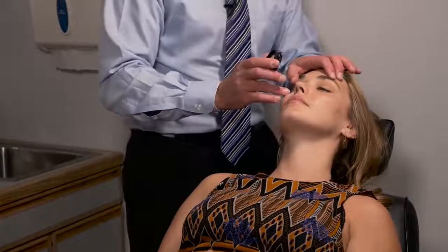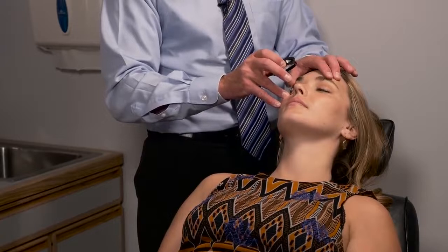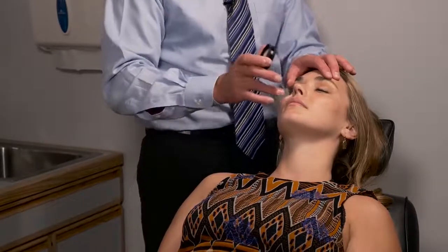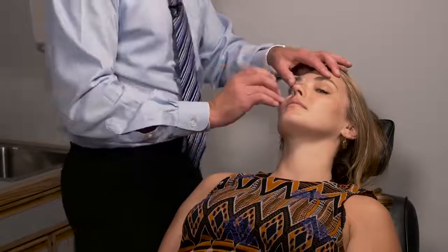All right. Look down and to the right. So in, I see the orange reflex. I pull back. There's a nice view of her retina. Look straight down. Down and to the left.